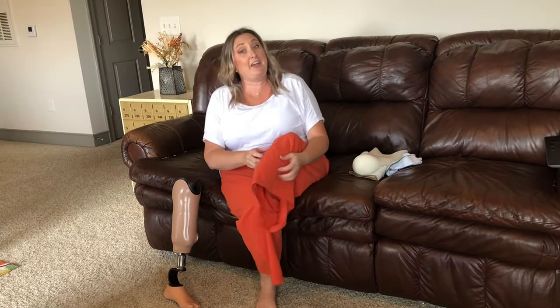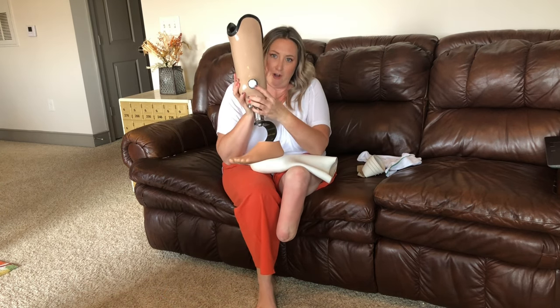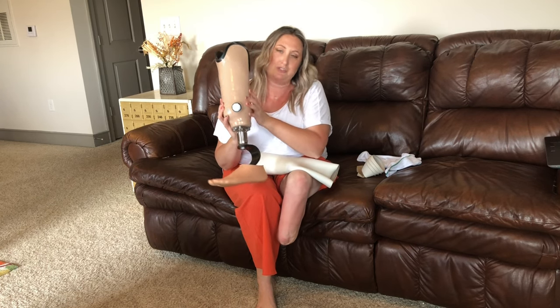Eight weeks after my elective amputation of my left leg, I was fitted for my very first test socket. A lot of clinics don't make test sockets, so if that's something you want, make sure you find a clinic that does. My very first fitting was for a plastic test socket with a vacuum ring suspension system. The vacuum ring system is exactly that — it has a one-way valve on here. When I push my leg in, the air comes out, and this allows no air to come back in.